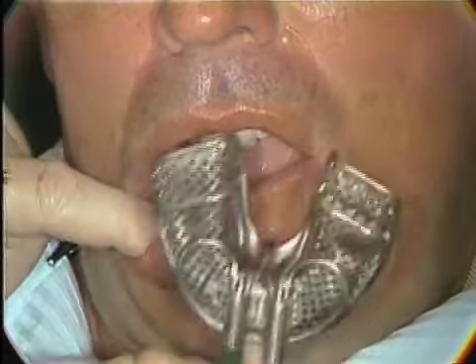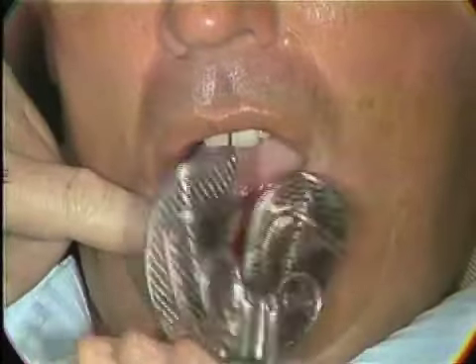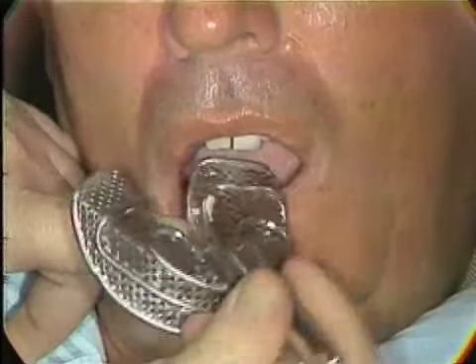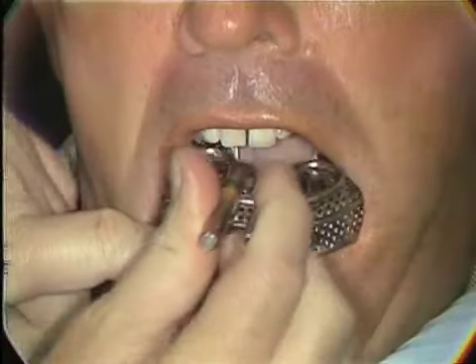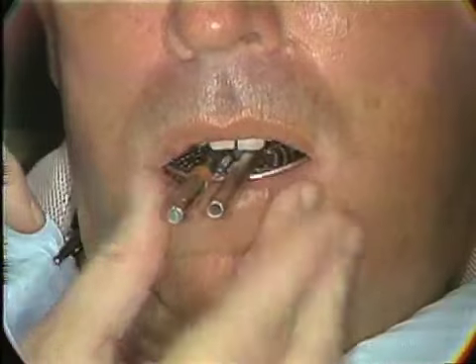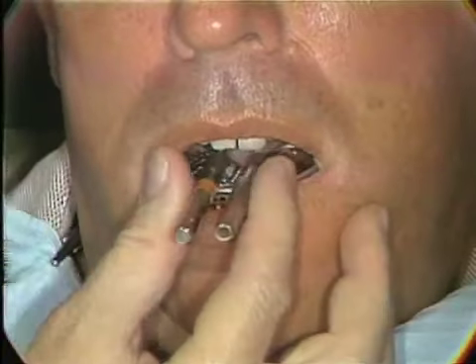This is a hydrocolloid impression. Some people seem to think that they can take a hydrocolloid impression and have a stable base, but the size of the tray, the water-cooled tray, would prevent us from getting those tissues in the resting position because of the bulky tray that we would have in the mouth.